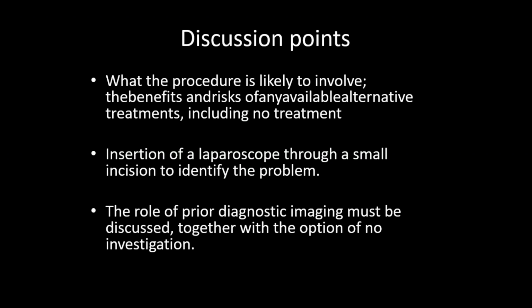You will give them antibiotics until repair of the problem, or until the support of your consultant or surgeon comes into the theater to help you correct this problem.